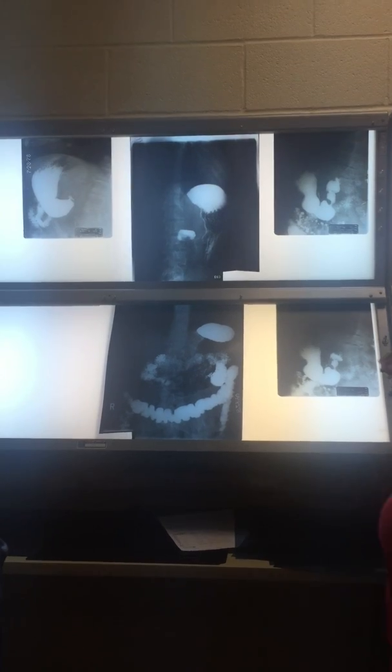And so that will show you either an AP oblique or, let's see, which oblique is this. So the obliques can be PA or AP. Remember, the barium is going to change position from AP to PA. So it's RAO or LPO. Those are the two you want to do. The esophagus is just RAO for the esophagus.